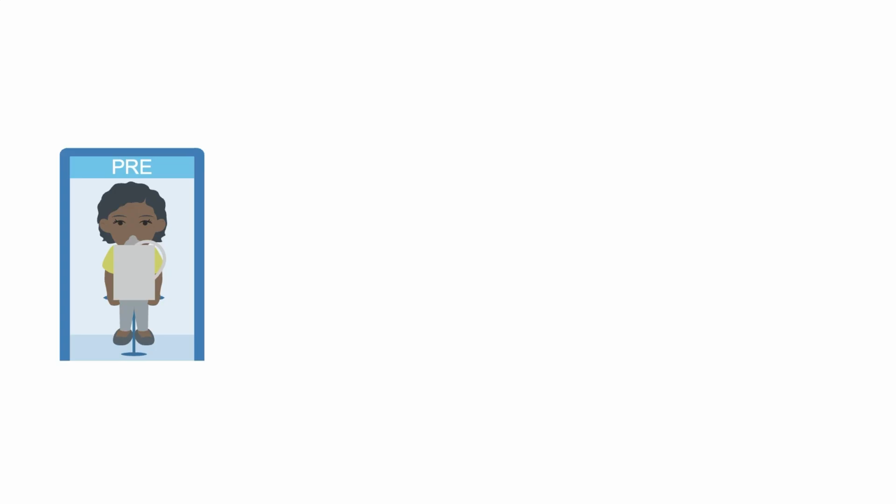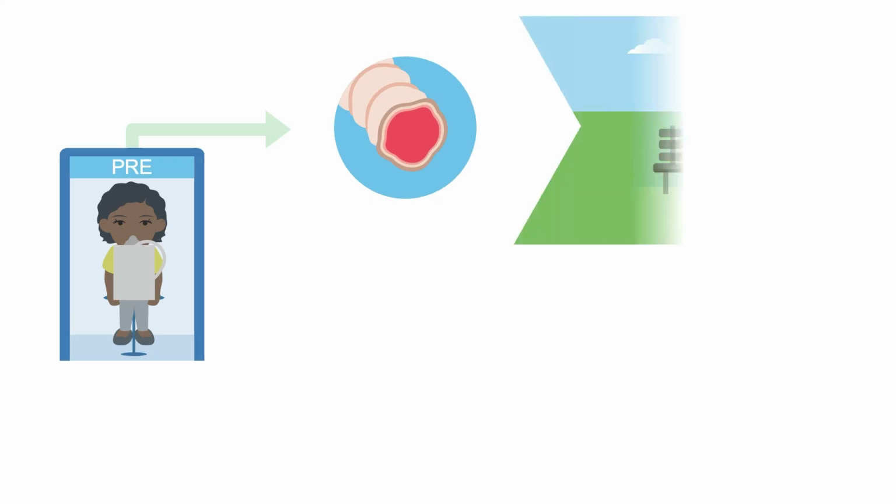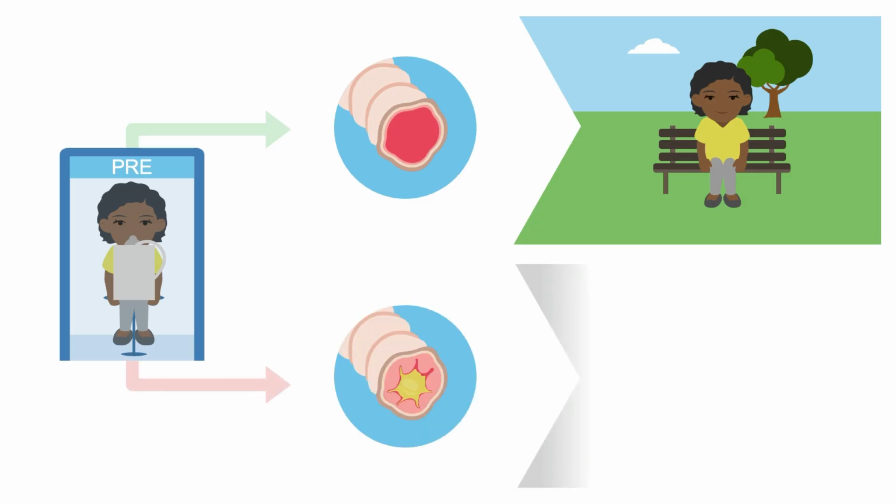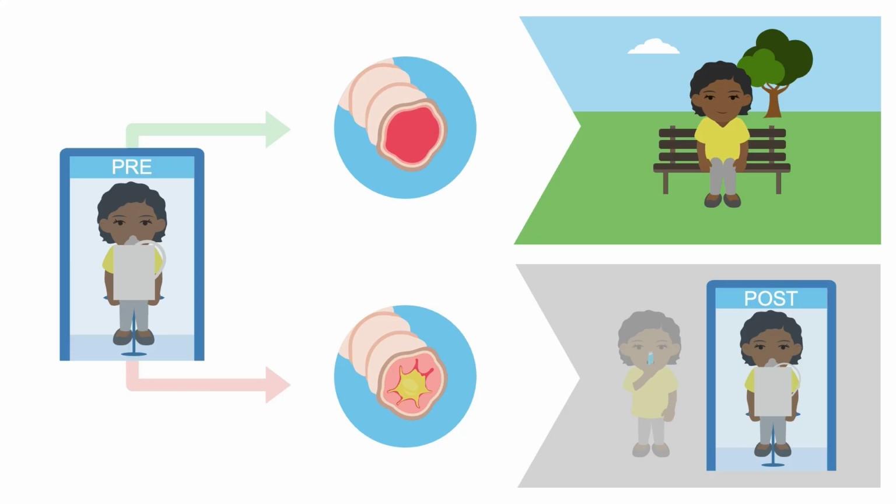But the guidelines have changed. If there's no airflow obstruction on the initial spirometry evaluation, there is no need to perform any post-bronchodilator spirometry. This adjustment significantly streamlines the process and reduces the need for patients to wait 30 minutes after bronchodilator administration. But if the pre-bronchodilator spirometry results are consistent with airflow obstruction, then COPD is confirmed using post-bronchodilator measurements.